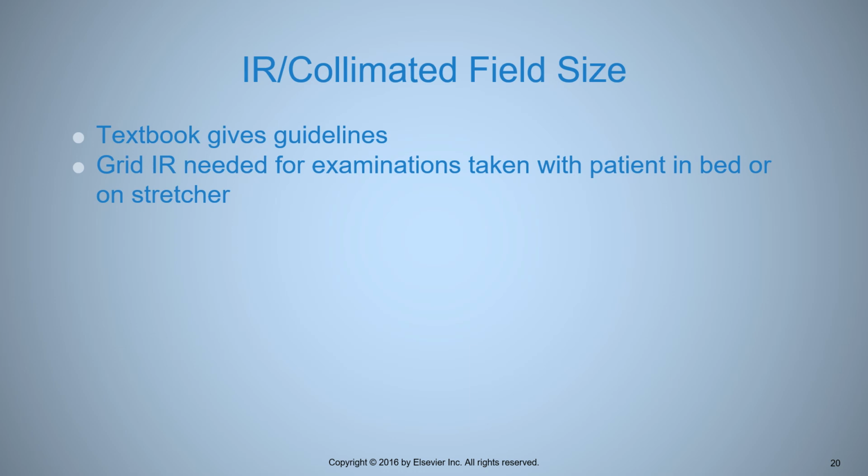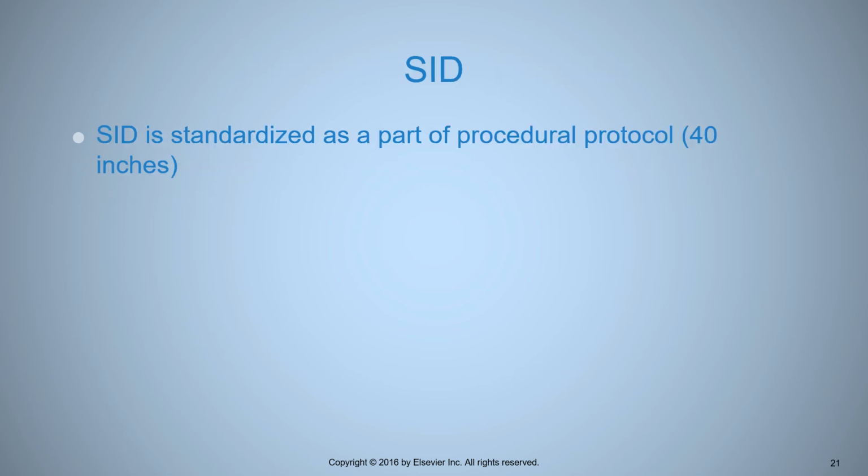And so you get a little bit more movability trying to set up that cross table. It's very handy for the patient's exam table to roll and pivot through the room into a diagonal, let's say. And then, of course, your x-ray tube is also on wheels. It's just a lot more convenient to set up those cross table shots portably, and they can be done portably with equivalent quality. All right, SID 40 inches. I don't think we're going to deviate from that.